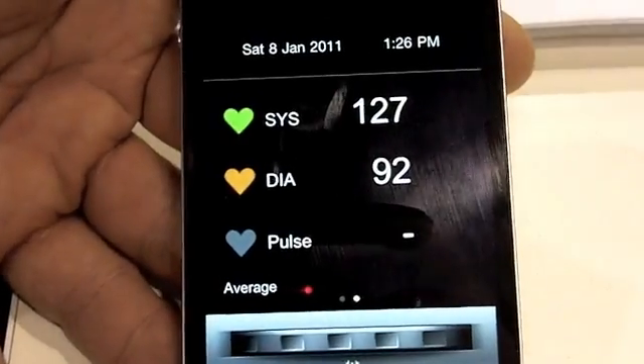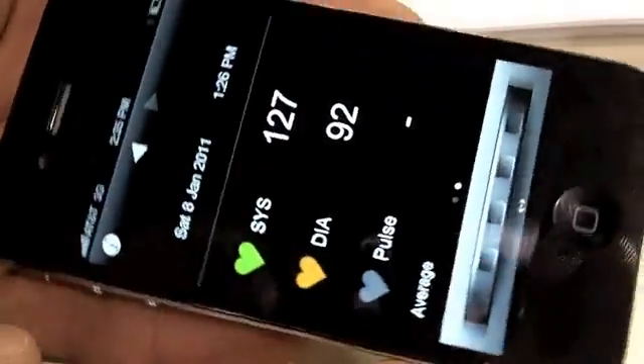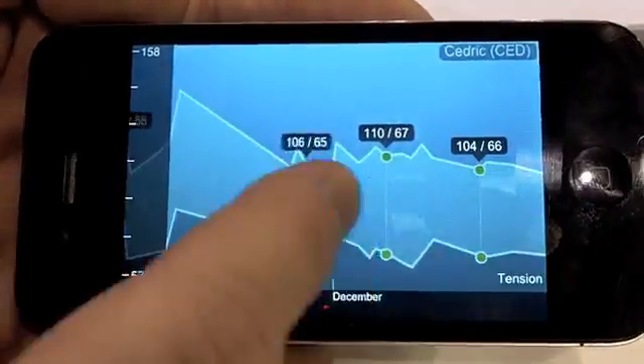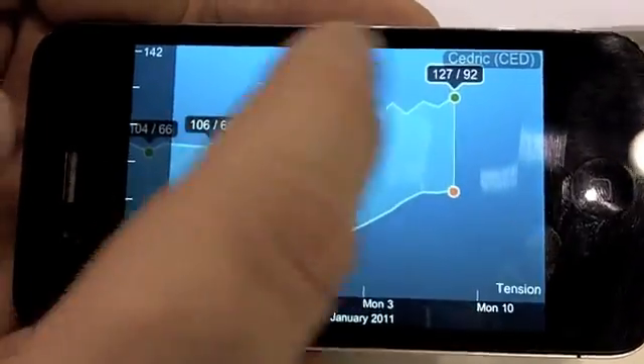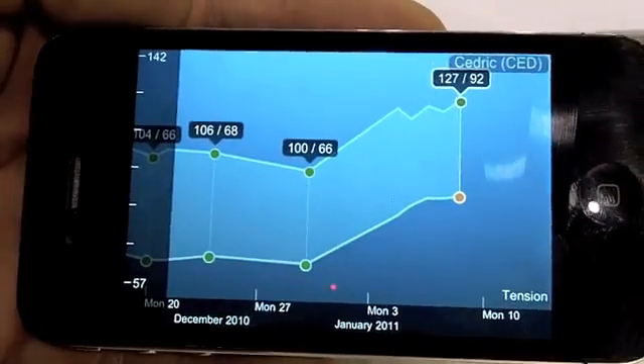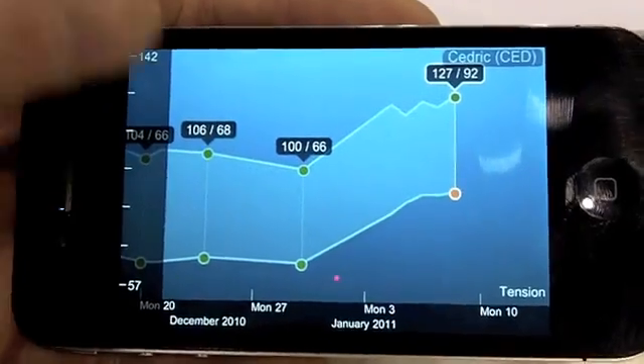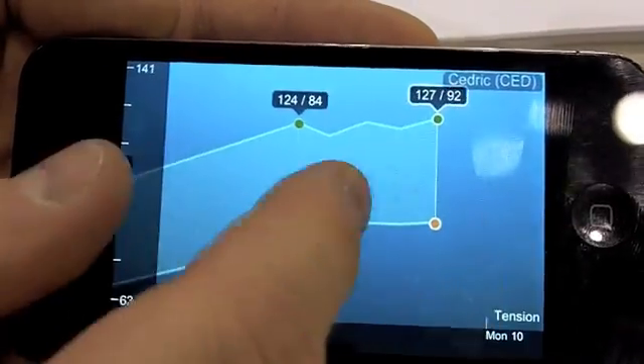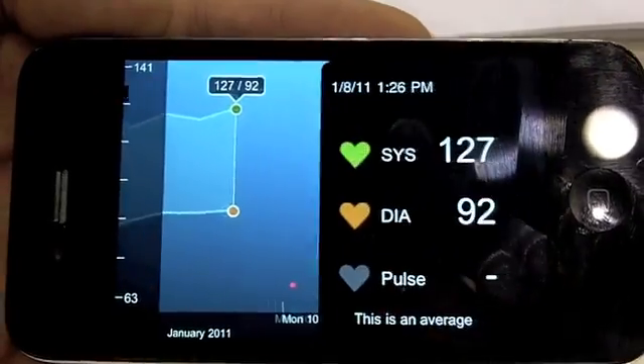Now I can see my blood pressure environment. I can see the hypertension CES period here — I'm a bit high blood pressure during the CES. I can zoom in and have the full detail of one measure.